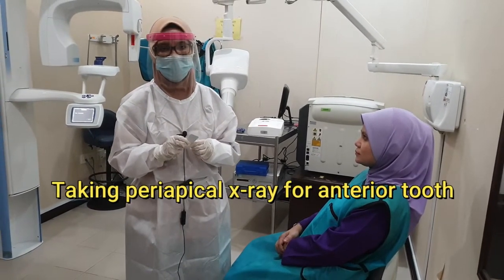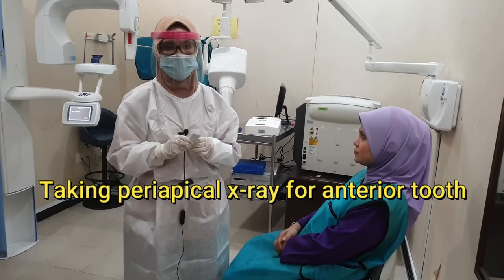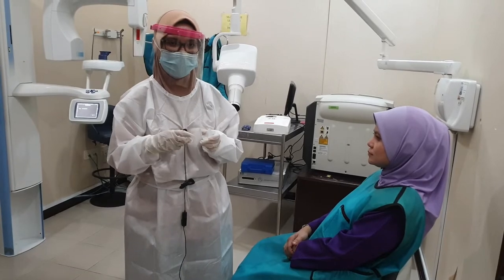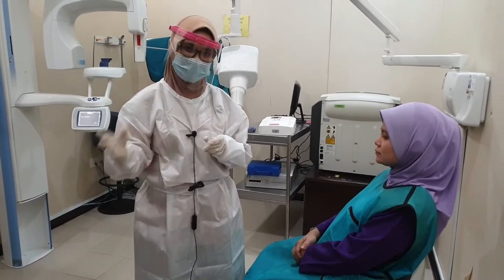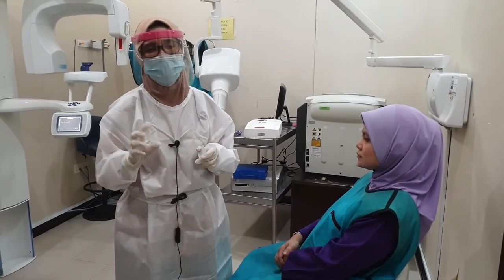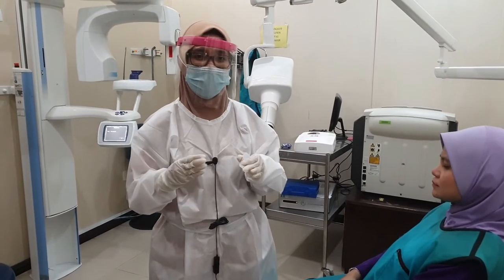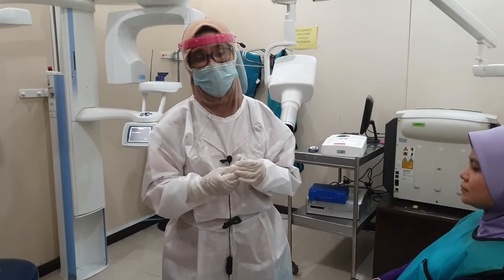I will show you how to take the periapical radiograph using the bisecting angle technique. Ideally, we want you to take it using the parallel technique, which is obtained by using the X-ray holder. But in certain situations you won't be able to do that — for example, in a patient with a narrow palate shape, it is very impossible for you to use the holder.